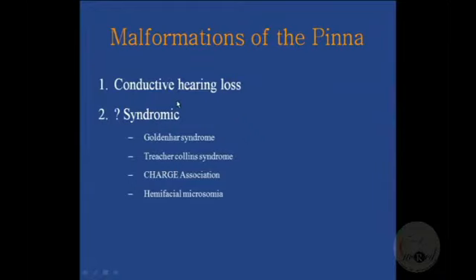So we are switching gears and going to the first branchial cleft cyst, and I included this here because it occurs very close to the external auditory canal. The second and third branchial cleft cysts are much lower. I didn't want to talk about it.